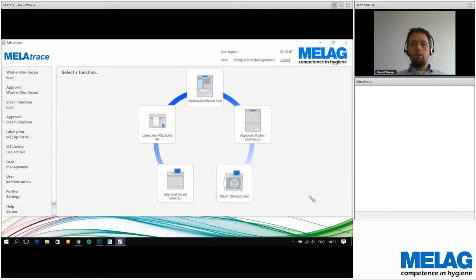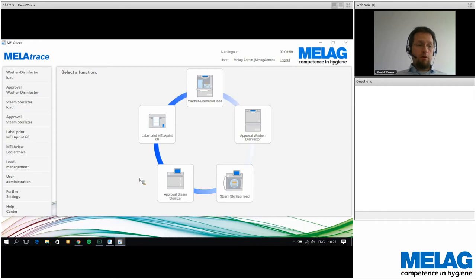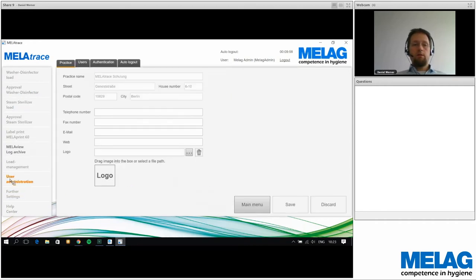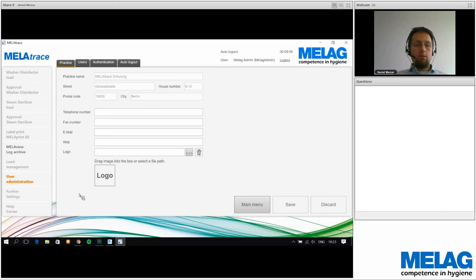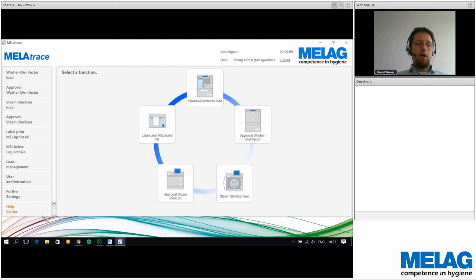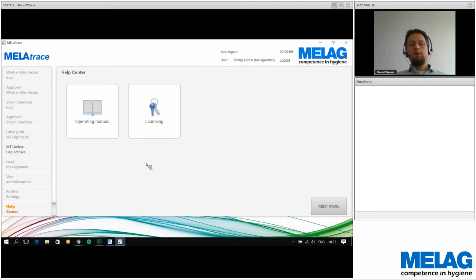With the license applied, MelaTrace opens and configuration can begin. The first step should always be to check the user administration — verify the address, street, house number, and other details. If everything is correct, proceed with the user administration configuration. If there's a mistake, contact Mela immediately to issue a new license. Re-implementing a license is easy via the Help Center's licensing button, where you can request or implement a corrected license.